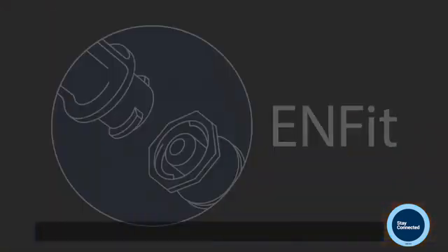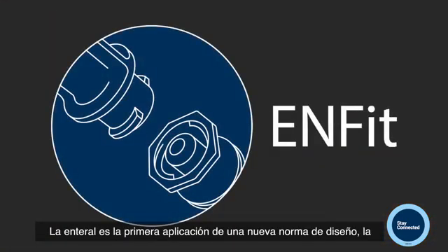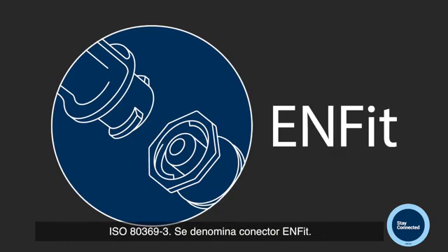In order to make this happen and not overwhelm the healthcare industry, the first connector that has been developed is the enteral connector, which will be phased in first. Enteral is the first application to launch a new design standard, ISO 80369-3. It is called the ENFit connector.